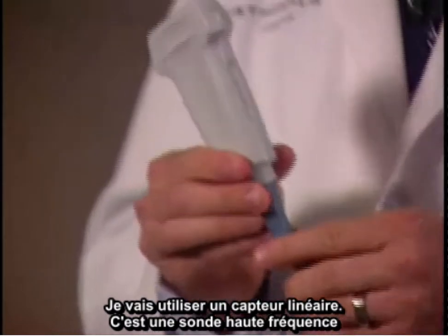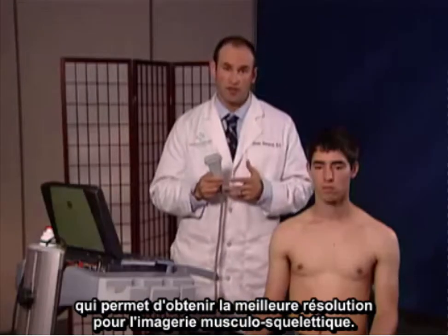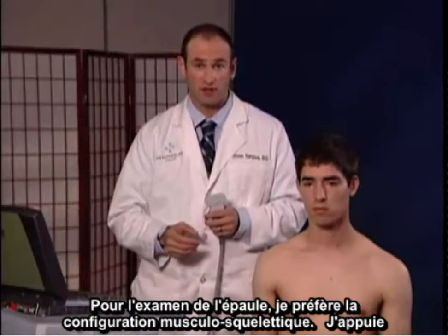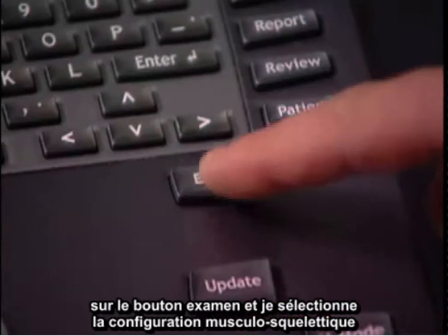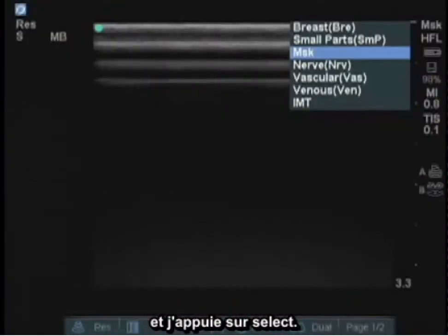I'm going to be using a linear transducer, which is a high-frequency probe that allows us optimal resolution in musculoskeletal imaging. With examination of the shoulder, I prefer the musculoskeletal setup. I press the exam button and check to make sure that I'm on the musculoskeletal setting and press select.